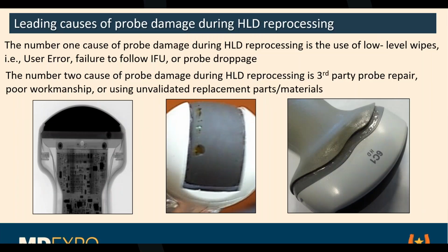When the chemicals are validated, this whole thing should be intact. If not, bugs will get in there as well, and they'll hide out, and you get cross-contamination issues. Same thing down here. Even though this probably doesn't touch the patient, there are bugs that will hide in here, but it gives a fluid ingress path into the electronics of the probe here.